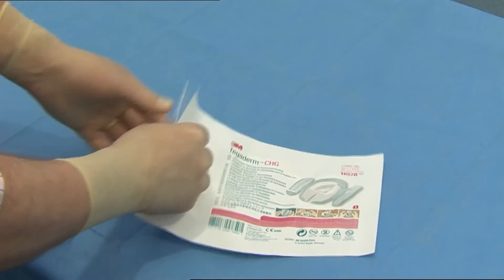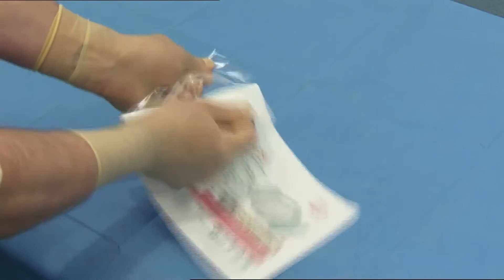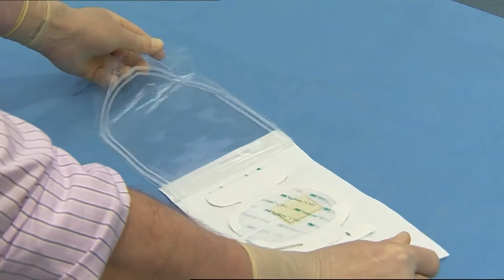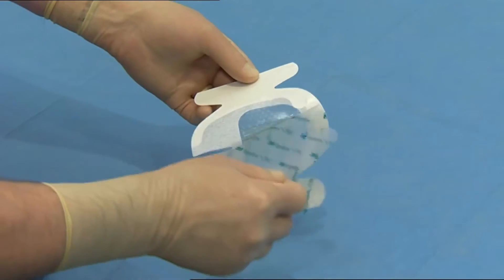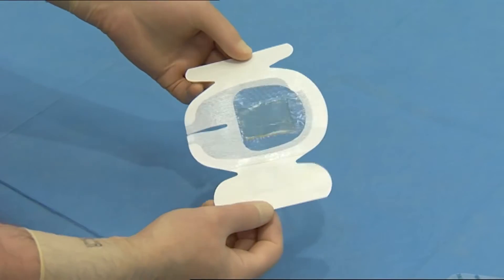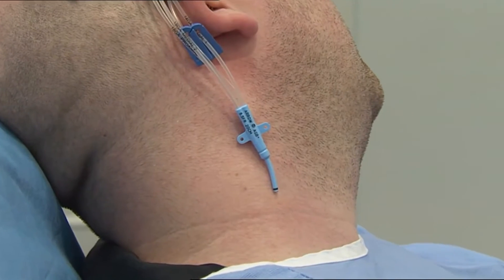Open the packaging and remove the sterilised dressing. Pull off the protective film from the adhesive surface of the dressing. Turn the dressing so that the adhesive surface is facing the surface of the skin.